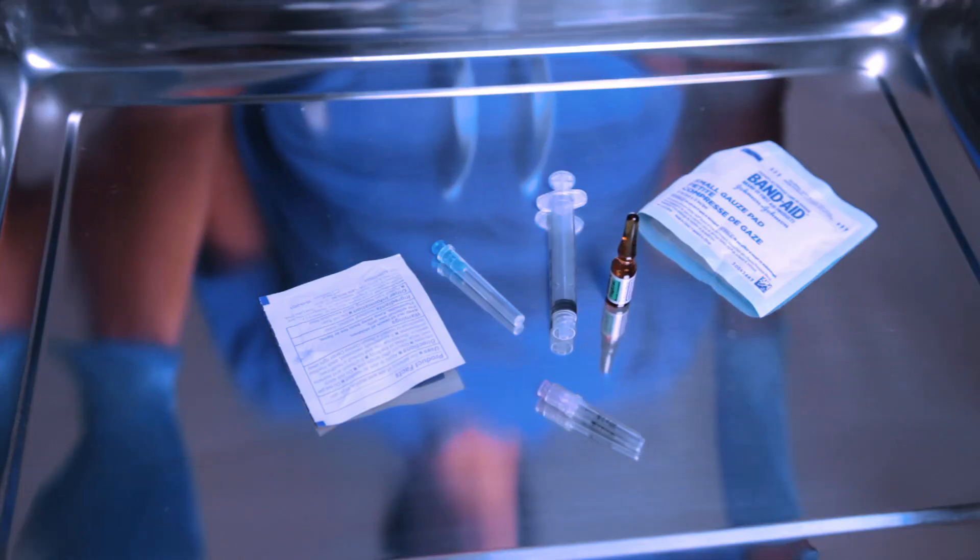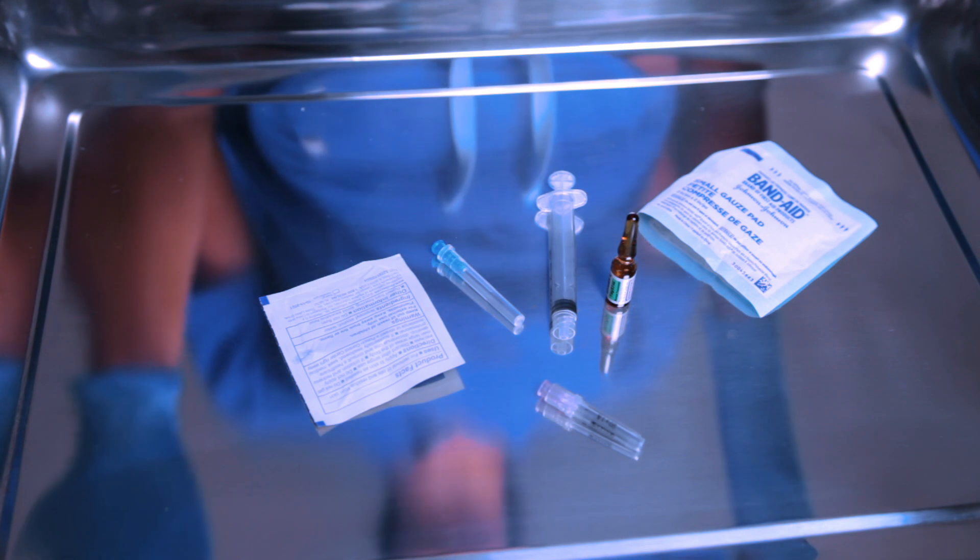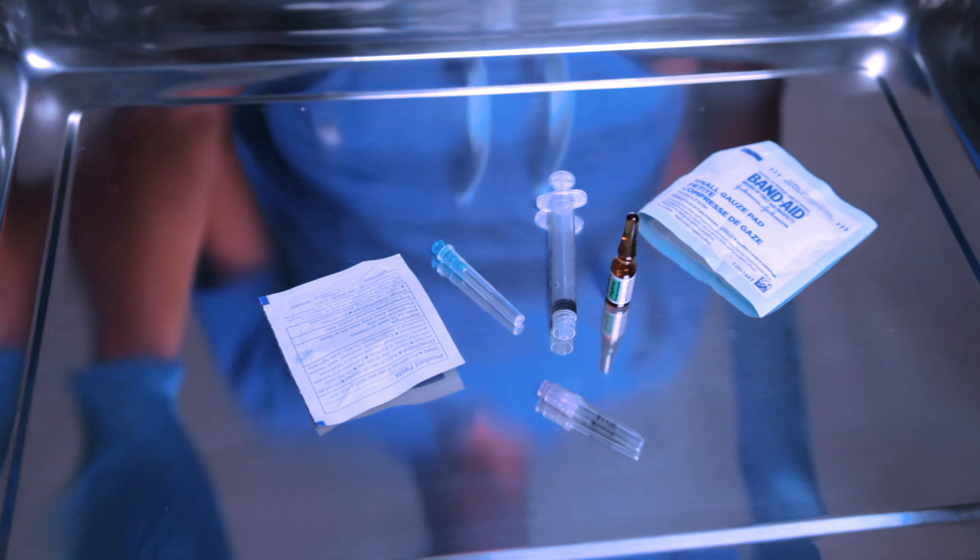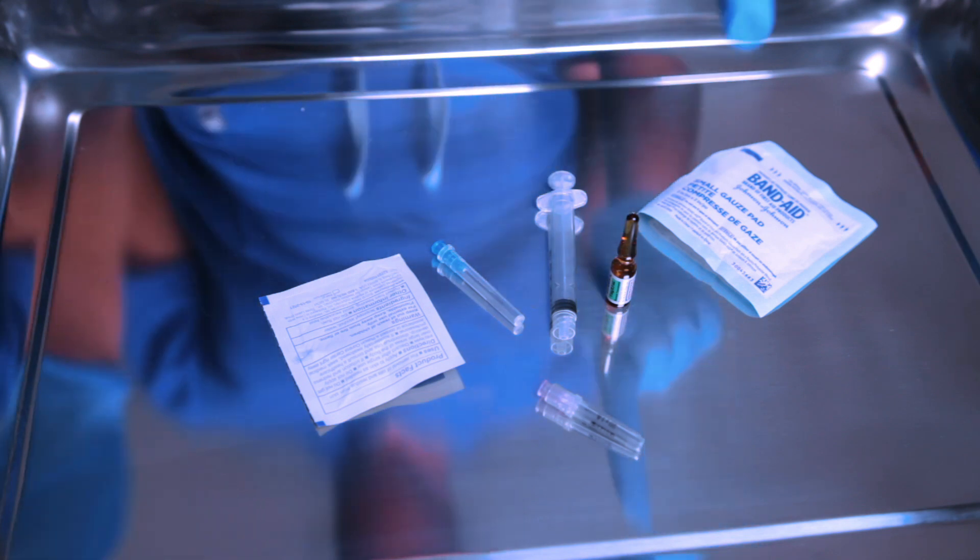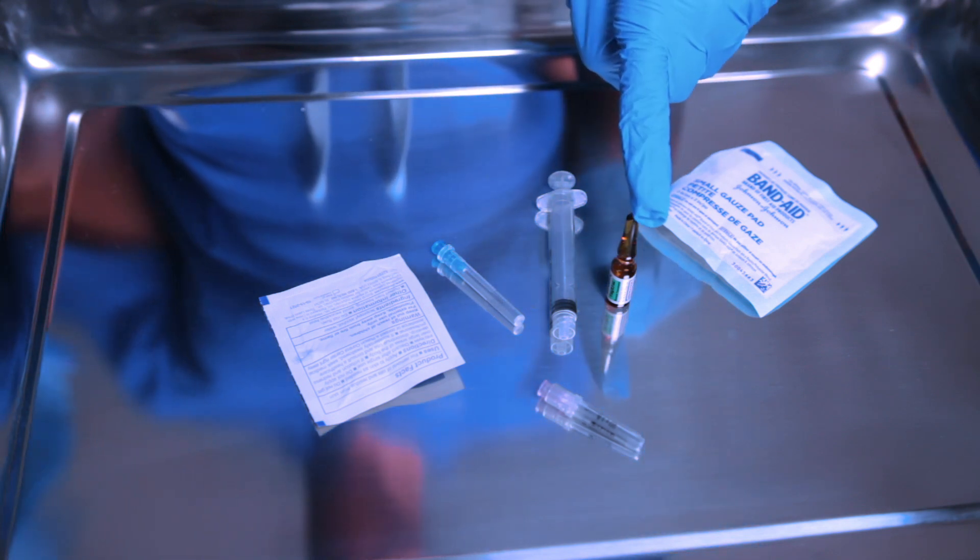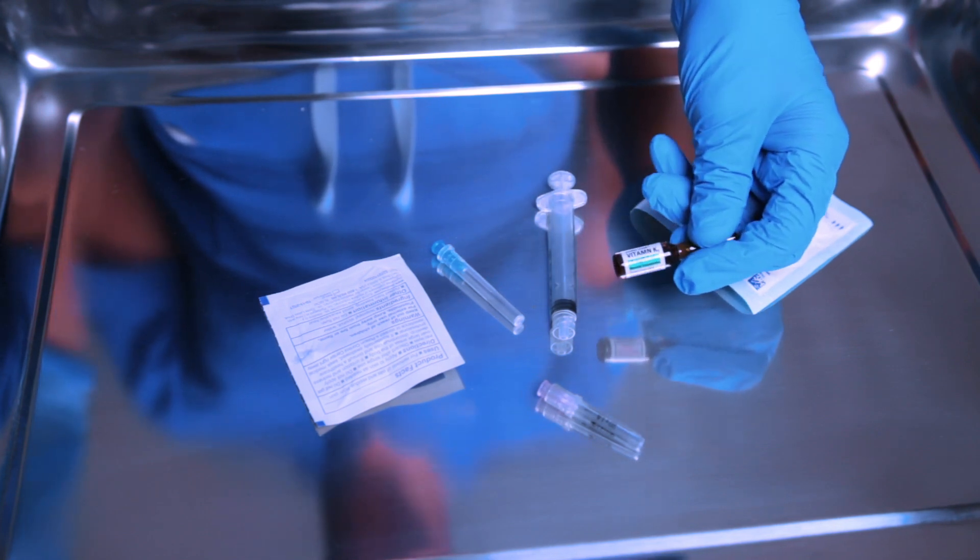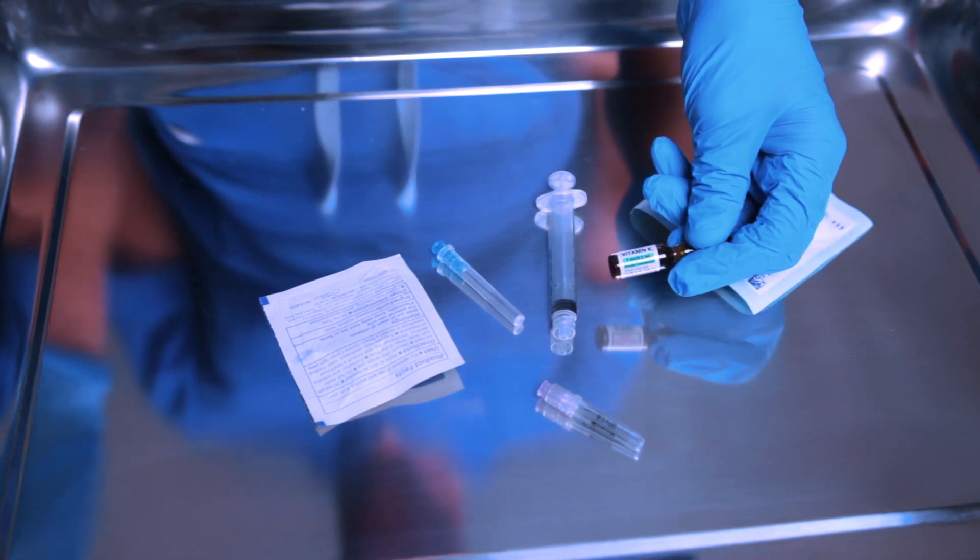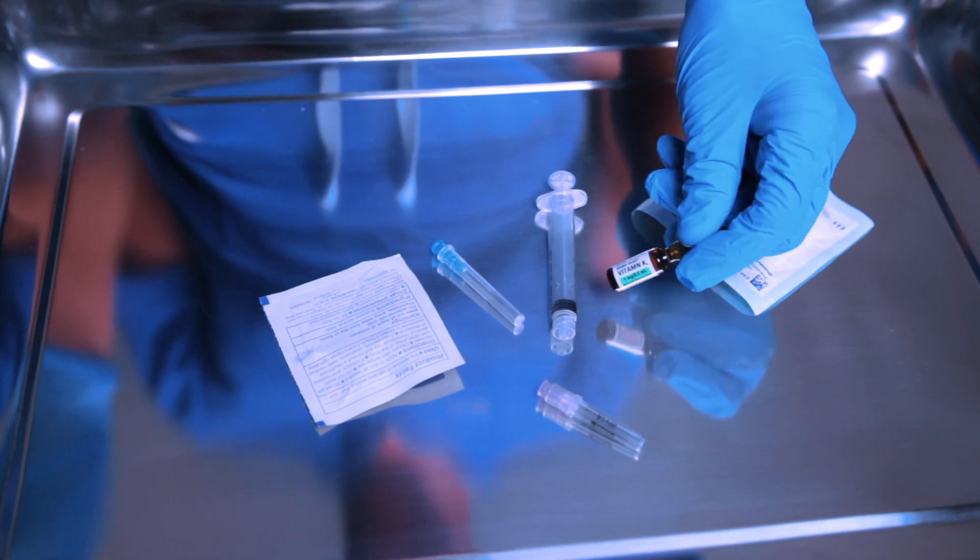So prior to administering your medication, you want to verify that you have a physical order that you will be administering the medication to your patient. You are going to gather all of your supplies. You will need your vitamin K injection. In this situation, this is going to be for your pediatric population. However, you can give it for your adult population as well. So this is dosed at one milligram per 0.5 mils.